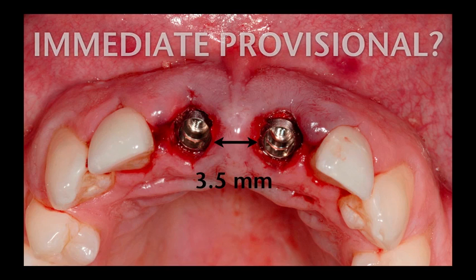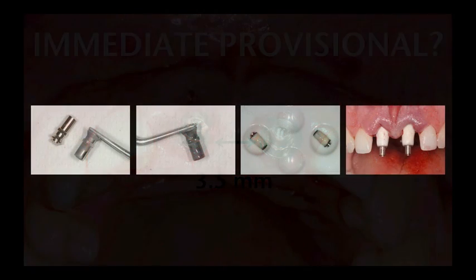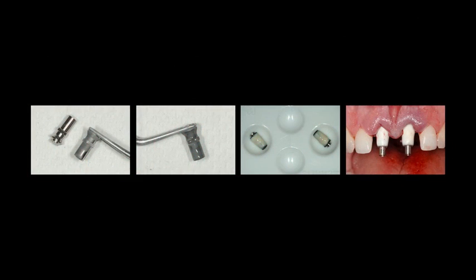And the patient had essentially almost an anterior open bite, so we felt that we could do this without putting a lot of function or pressure on the provisionals. So basically we decided to make some immediate provisionals. I'm going to take some Straumann posts.